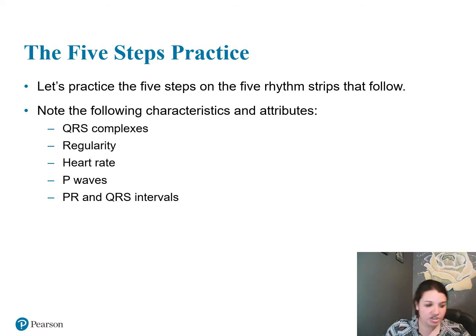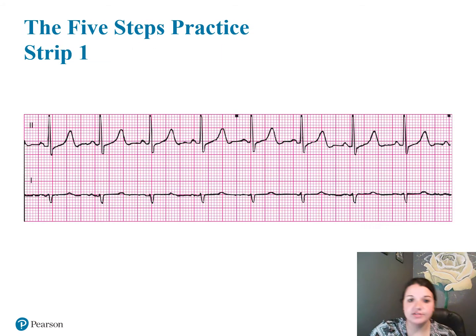Your second question, is it regular or is it irregular? Third question, what's my heart rate? Fourth question, are there P waves? Yes or no? Fifth question, what are my intervals?